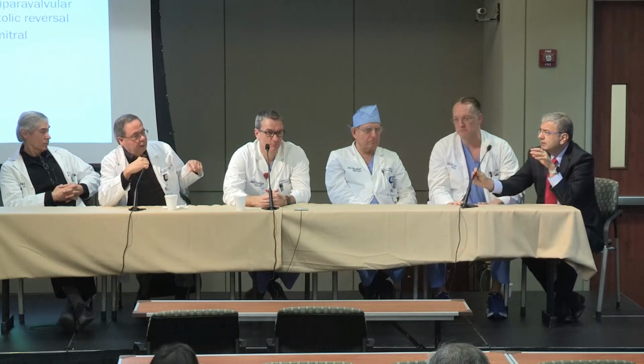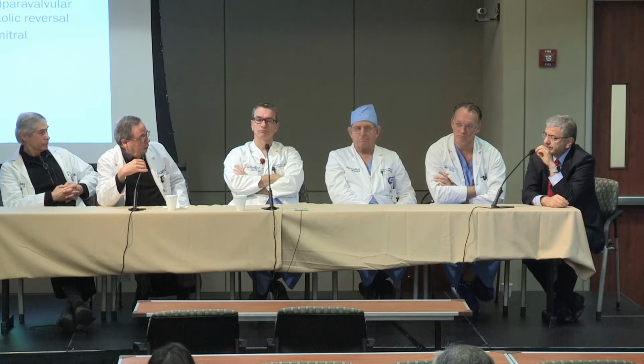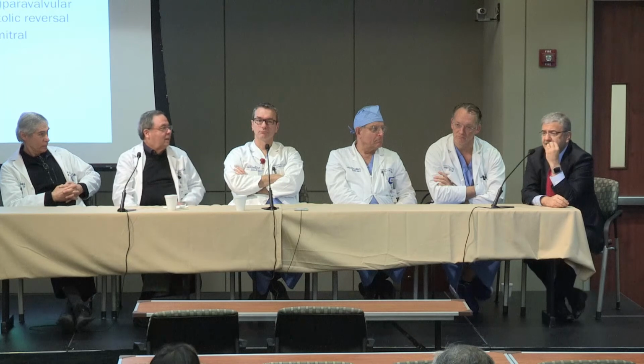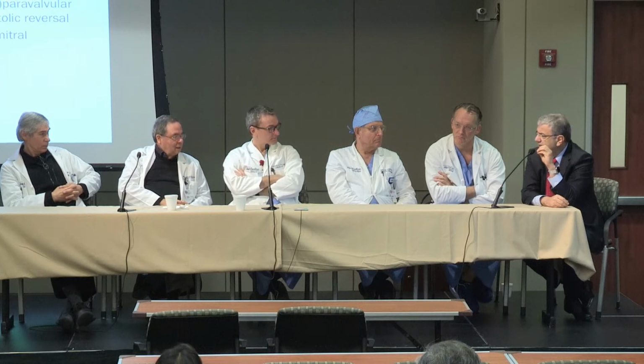From my own perspective, actually, I was very interested in the mitral regurg because sometimes we might not do quite as well. And in a 90-year-old who's very dyspneic, you also wonder whether the MR could be worse than it was. But for the person who's going to go out and doesn't have a valve team to take a look at them, we have to be honest that the transthoracic echocardiogram, even the TEE, is not very impressive from a color Doppler point of view. And here is where the challenge of these valves lies. There are multiple areas of regurgitation, right? And how do you handle them?